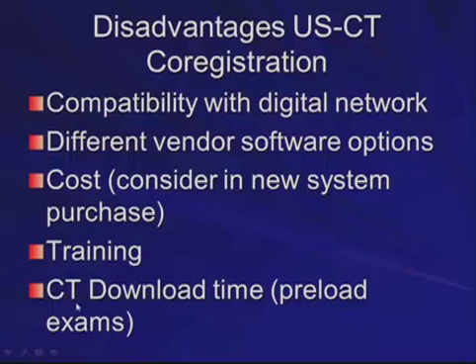And then finally, depending on your circumstance, the CT or MR download time may take a while. In our department, it's not a problem to download a CT or MR most of the time, but during our very busy periods, it can take a few more minutes. And so what we tend to do is we preload our exams. If we know that a patient has a previous CT or MR, we just have that preloaded before the patient arrives.